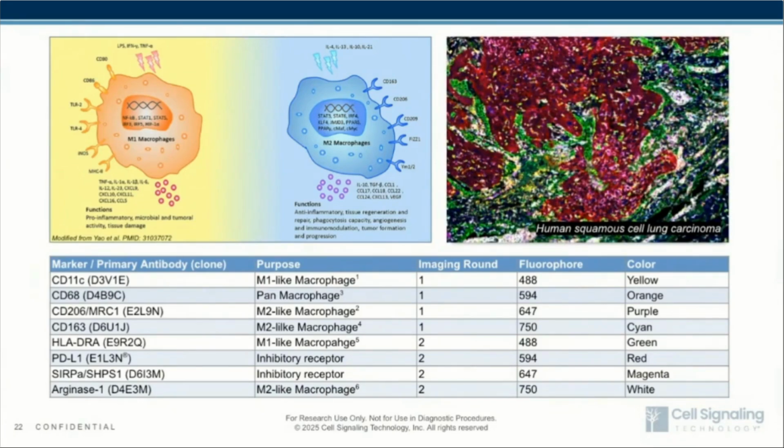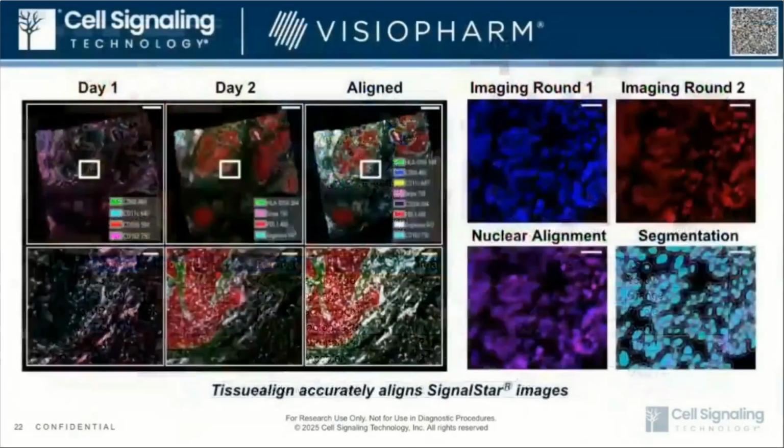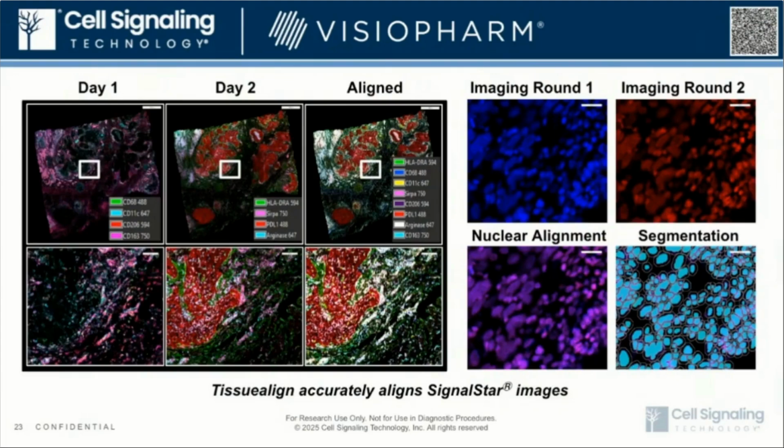And then for this study, I'll focus in on human squamous cell lung carcinoma that we dove deep into the analysis and to visualize the subsets in proximity to each other. So utilizing and partnering with Visiopharm and utilizing their software, we were able to view both the day 1 and day 2 images and use their tissue align software to accurately align the 2 different images into a single 8 plex image. You can see that here.